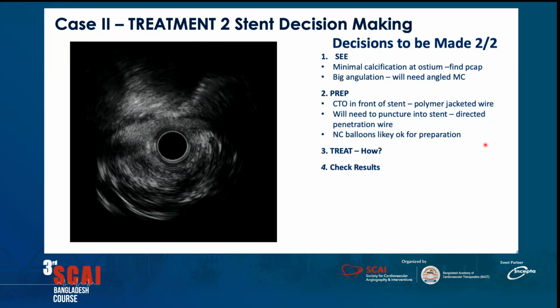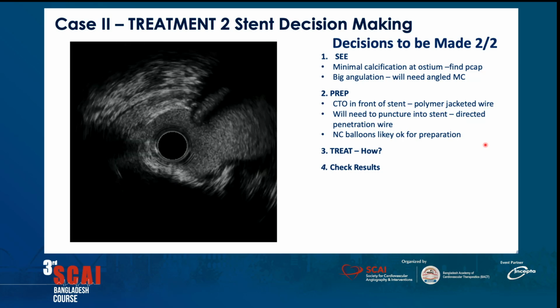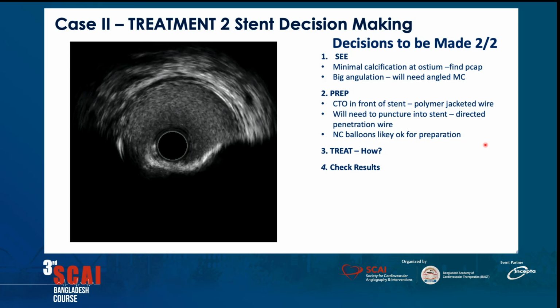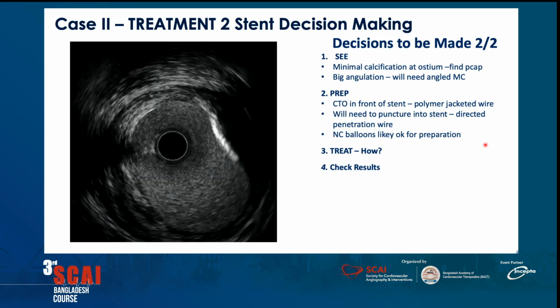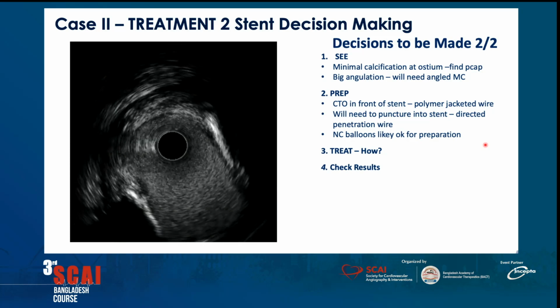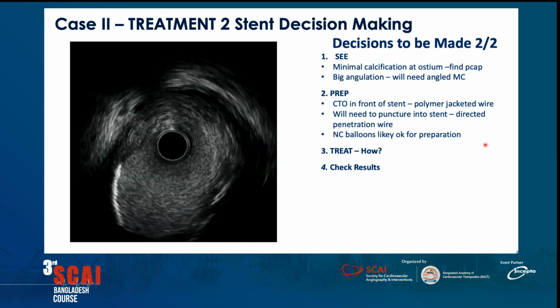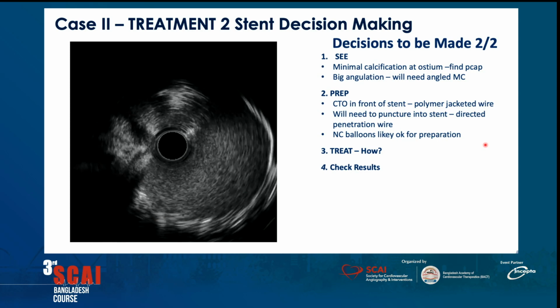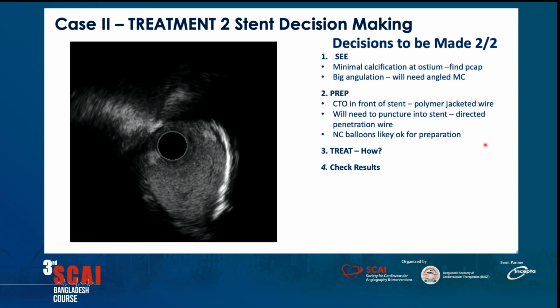And how are we going to check our results? We've got disease within the diag, it's coming back towards the ostium. The OM and the proximal circ are about the same size, and there's a bunch of distal circ disease as well. So this is sort of a complex bifurcation where you have disease in the branch that's longer than 10 millimeters, the angle's less than 70 degrees, and the vessels are, for what it's worth, reasonable size. So I chose a 2-stent strategy here.